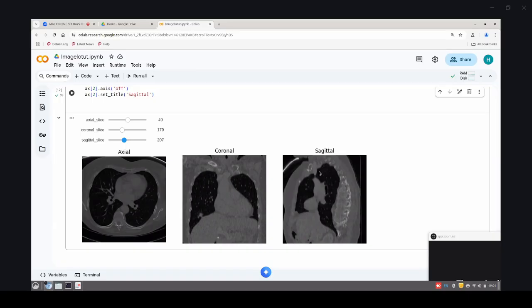So the idea I want to convey is that AI has to detect diseases in a 3D image like a CT scan or MRI, both of which are 3D images. You have to detect the diseases not only in one image but along all these slices to tell whether a person is normal or abnormal.